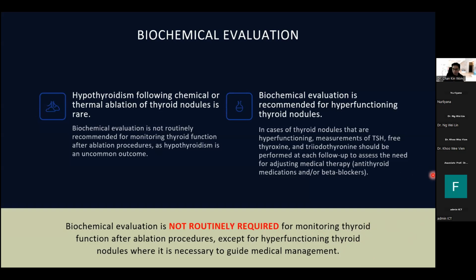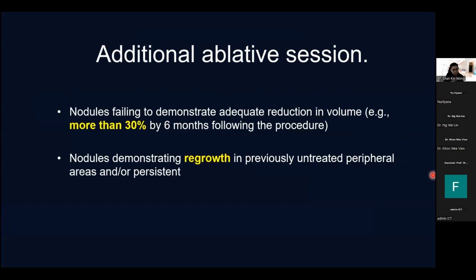Okay. For additional ablative sessions, nodules that fail to demonstrate adequate volume reduction, more than 30% by 6 months following the procedure, we need to consider additional ablative sessions. And for any nodules demonstrating regrowth, we would also recommend the patient go for another session of ablation.